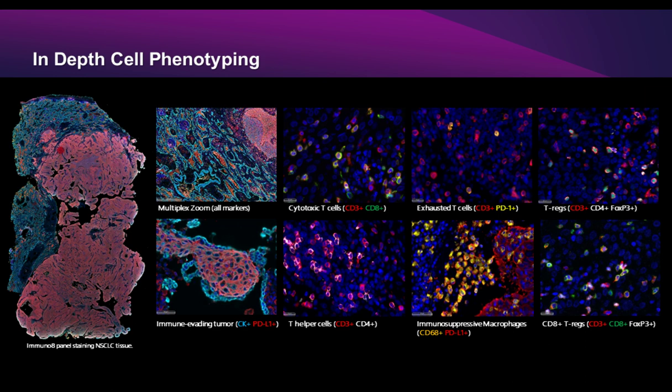that out properly. That process just to get set up is pretty time-consuming, but I think in our experience, we were routinely 6 or 8 months to get a 4-plex panel IF into production, and it was a significant amount of effort on our team.